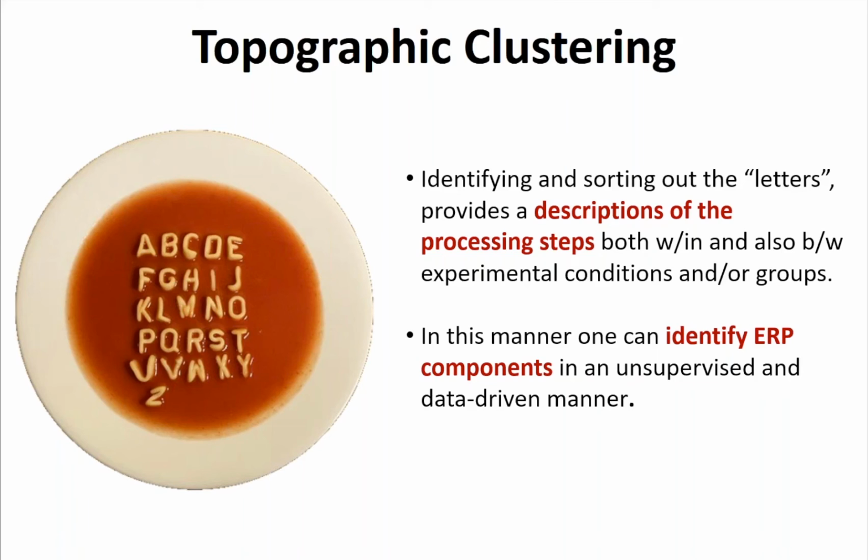There are, of course, other approaches out there, which people have surely heard of, whether they be principal component analysis, independent component analysis, and so forth. What I particularly like are methods that are unsupervised and data-driven when looking at the data. Cleaning the data is a different issue, in terms of being able to remove components linked to artifacts.